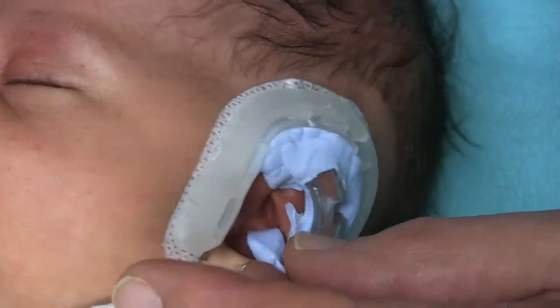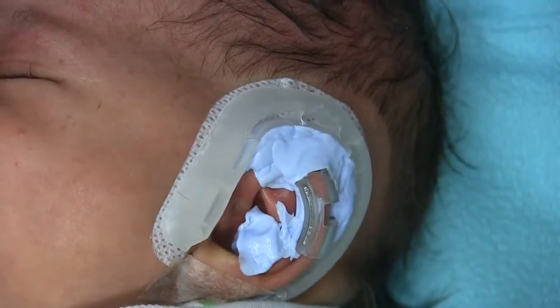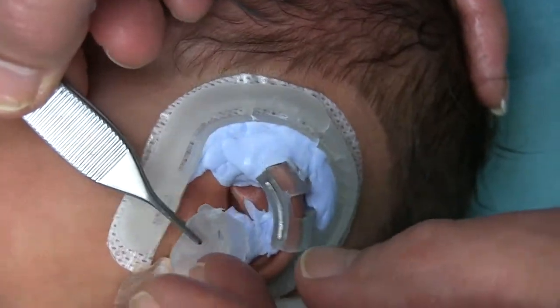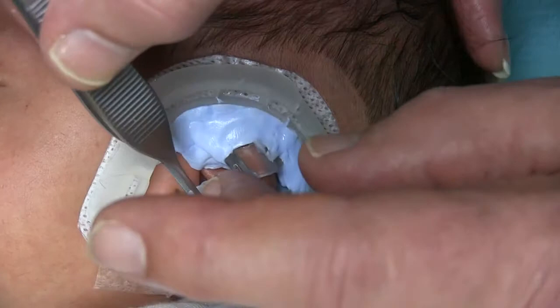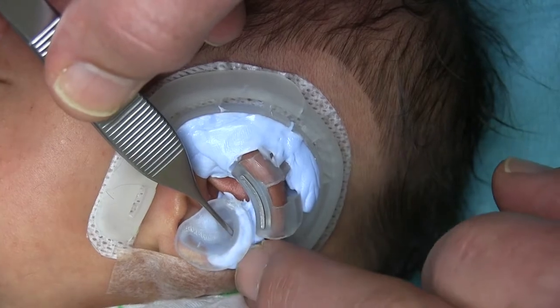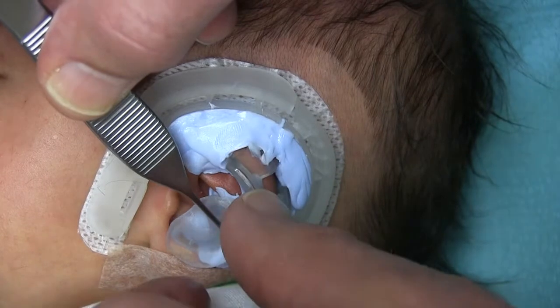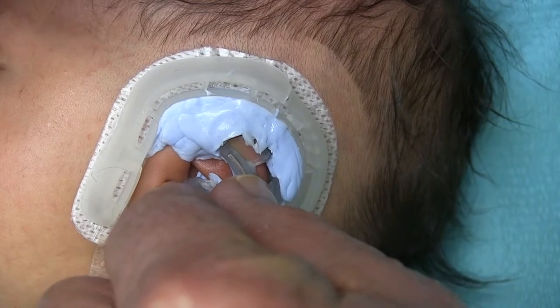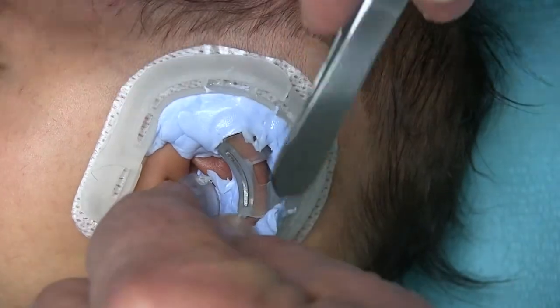Oh, that little bump there — see this bump here? That can cause his ear to stick out too far. So I'm trying to make this mold so it fits to push that down just right. That's all I'm doing. This is the important part. Let's see if this will just let that shape around it. Perfect. That may need just a touch of that right back there to keep it down. Yeah, there you go.